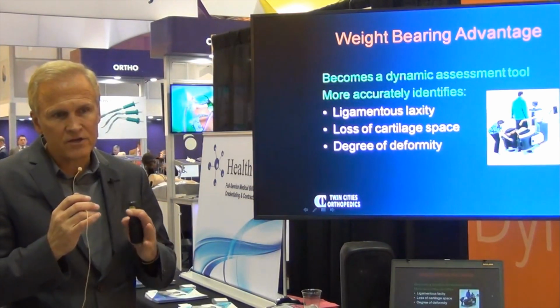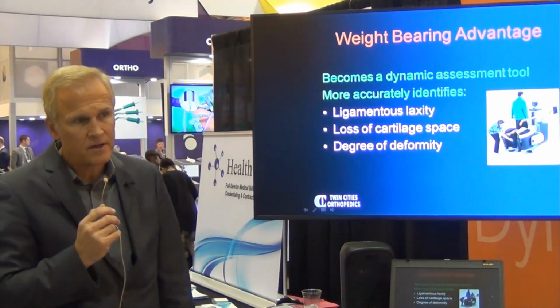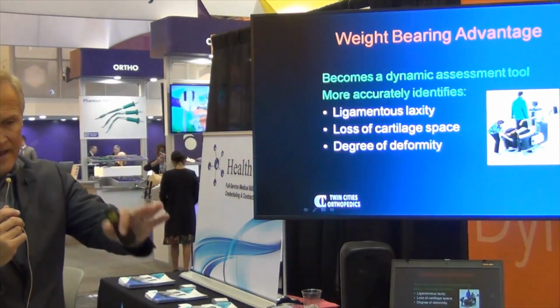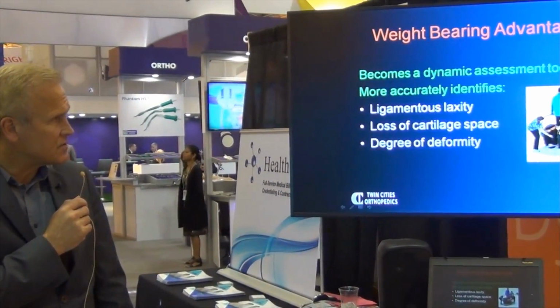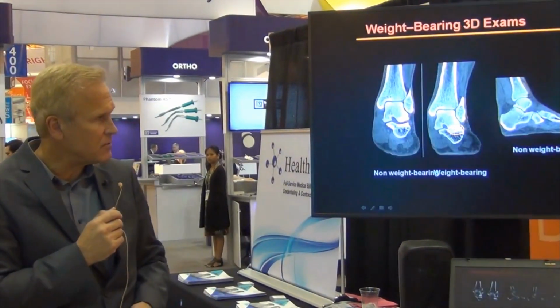Is just a reconstruction with some osteotomy going to work, with the posterior tibial tendon reconstruction? Or is the deltoid so loose and the spring ligament so shot, and the laxity on weight bearing so extensive, that fusions are probably a better option for those patients. So then again, the loss of cartilage space and degrees of deformity can be clearly seen with the weight bearing part of this technology.